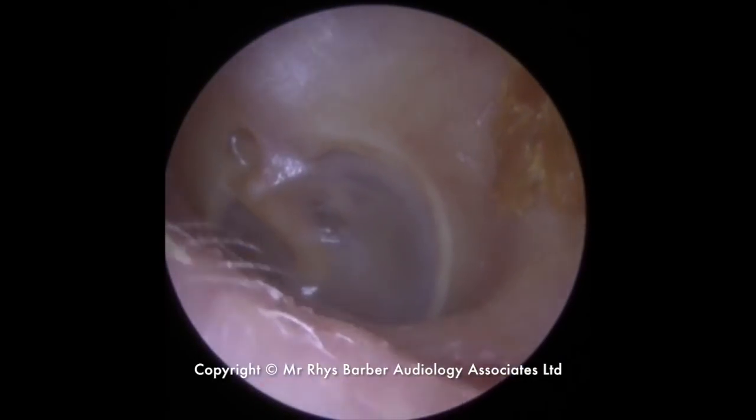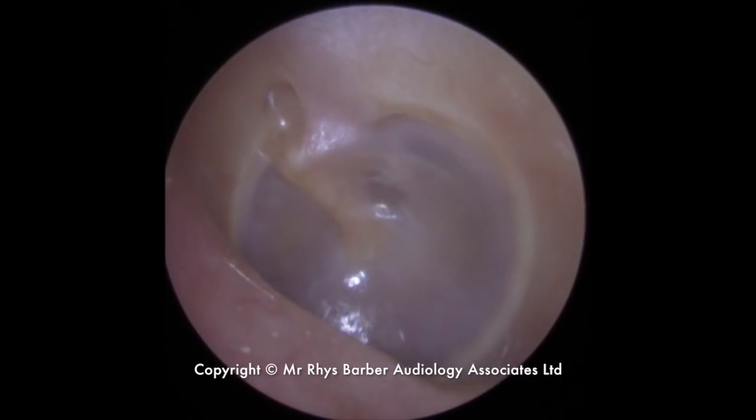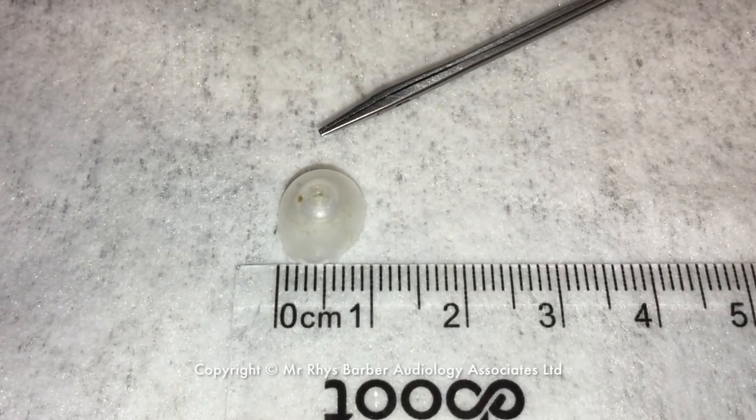So we'll take a look now. We can see the ear canal looking completely empty now. We have the eardrum there — slight retraction, which means the skin of the eardrum is a little bit pulled in there as well.